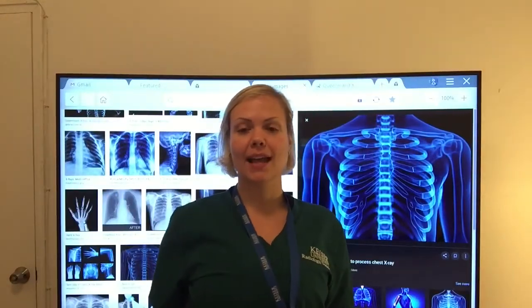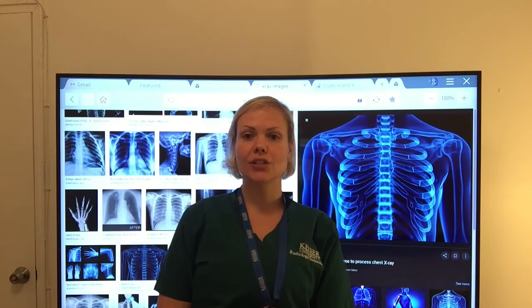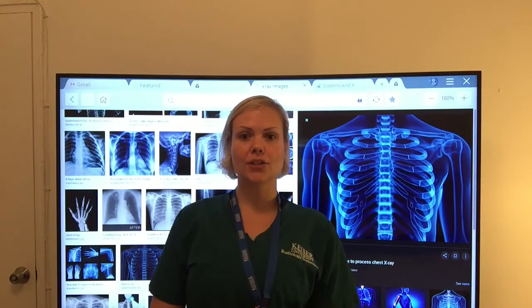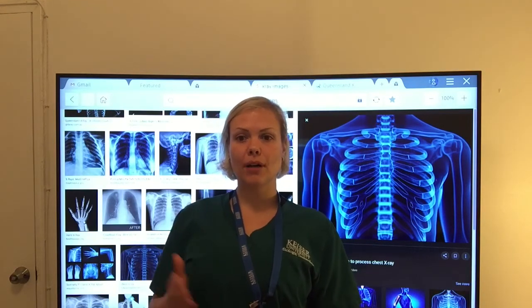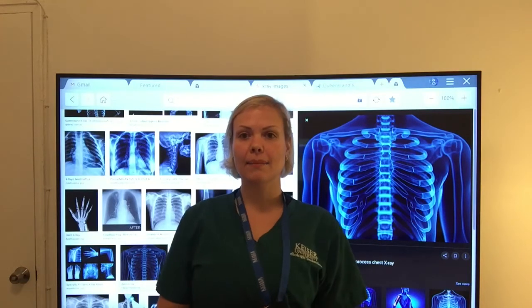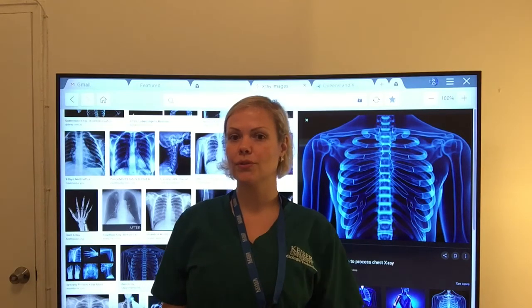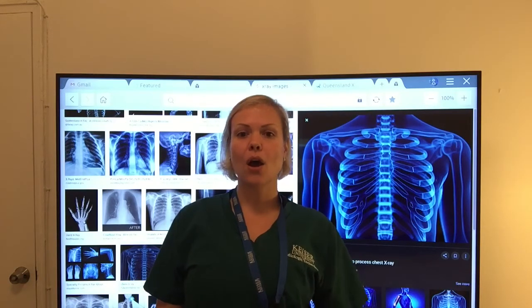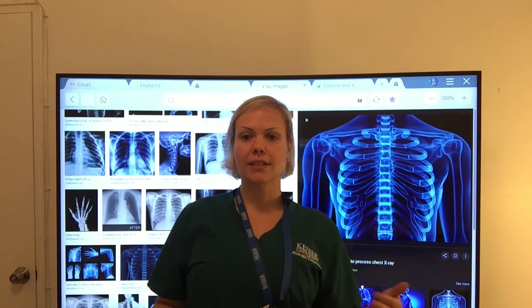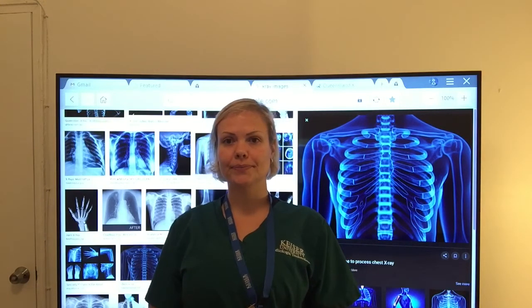Density control adjustments. AEC systems are equipped with density control that allows the radiographer to adjust the amount of projected radiation. Usually, they are in the form of buttons on the control panel, labeled as -2, -1, 0, +1, +2, and so on. The real numbers placed on the density control vary. All the numbers change the time of the exposure by a projected amount that is expressed as a percentage.